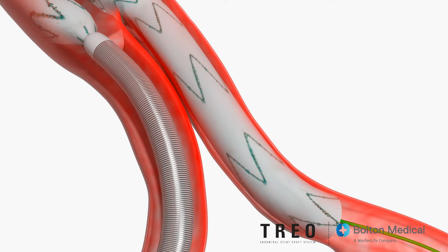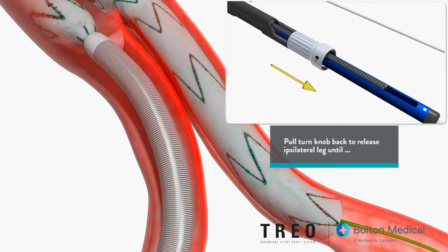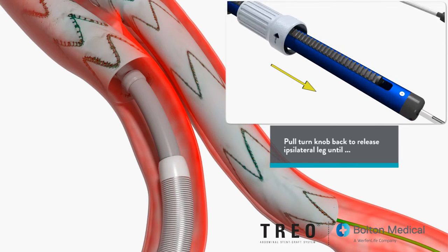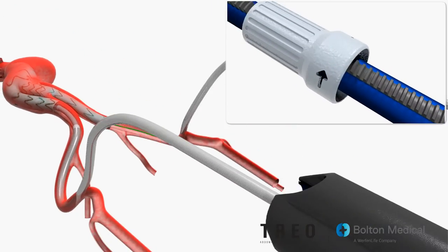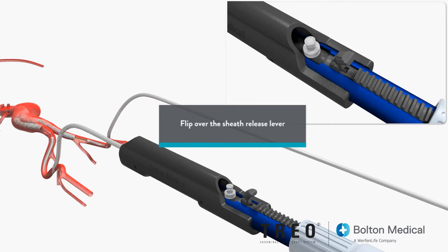Finalize the main bifurcated stent graft deployment by pulling the turn knob back to completely release the ipsilateral leg. Continue to pull back until the lead screw stop is seated against the back end of the delivery system. To release the sheath from the delivery system, completely flip over the sheath release lever until it clicks into place.